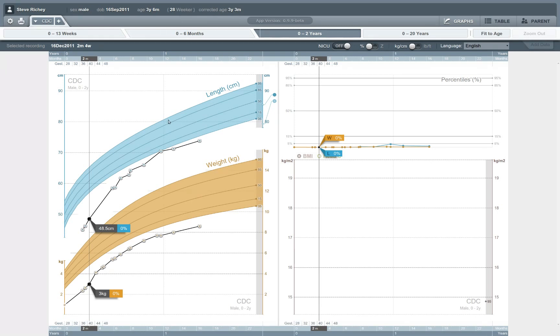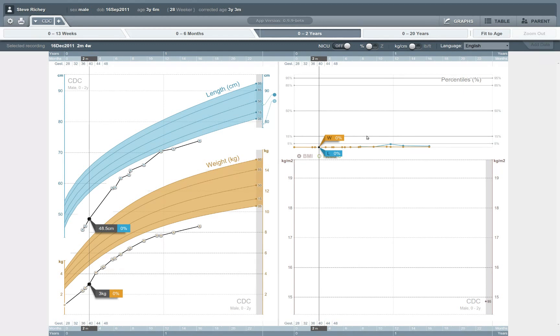On the left-hand side of the screen here, we see a fairly traditional-looking view of the length and weight of a child as the child grows over time. The x-axis here is time, and we can see length in centimeters and weight in kilograms. On the right-hand side of the screen, we can see body mass index and head circumference that are plotted as well.